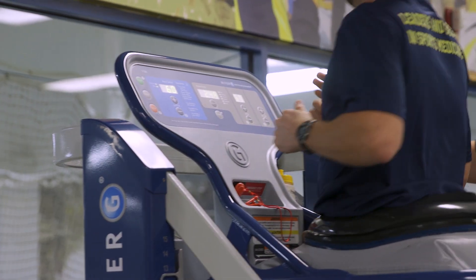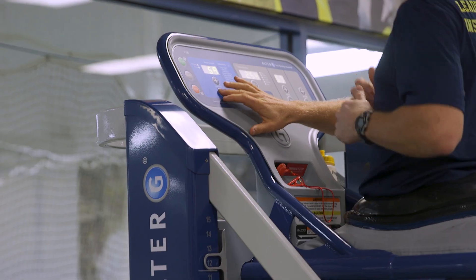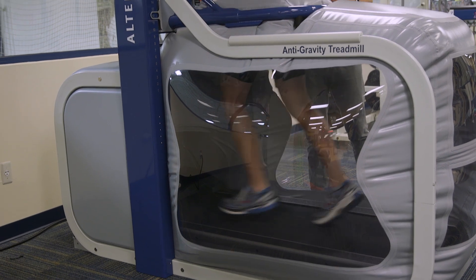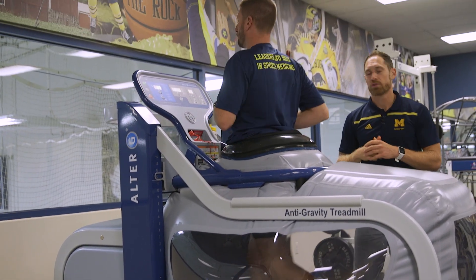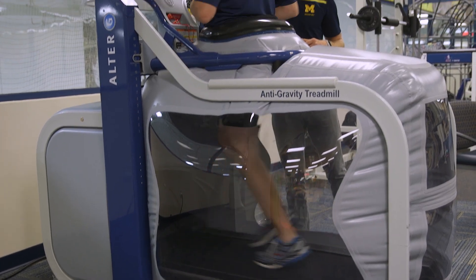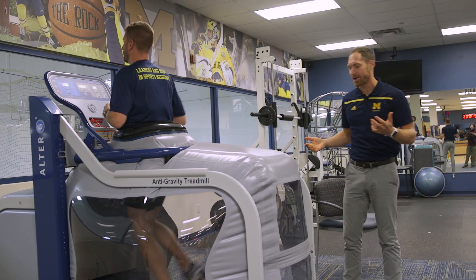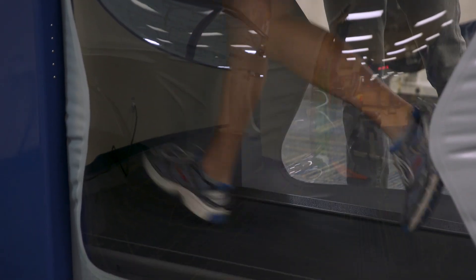So let's say we wanted to take him into an even more unweighted position — the machine goes all the way down to 20% of body weight. So we'll incrementally go down. Now we're as unweighted as we can be with this machine; he is now running at 20% of his body weight. At that point it is going to be pretty challenging to run with normal mechanics because you are so elevated.